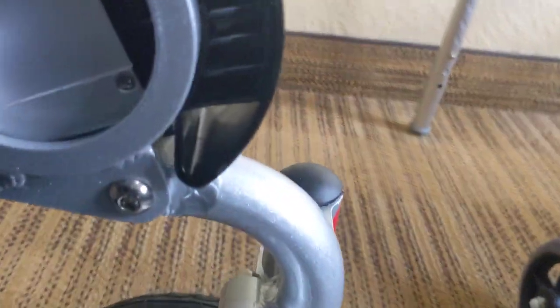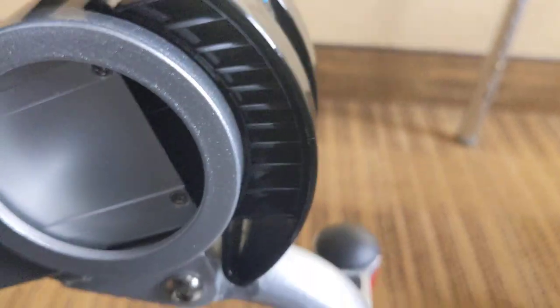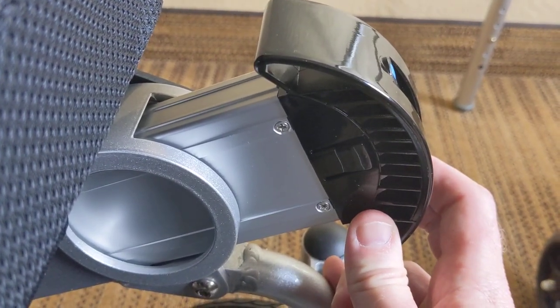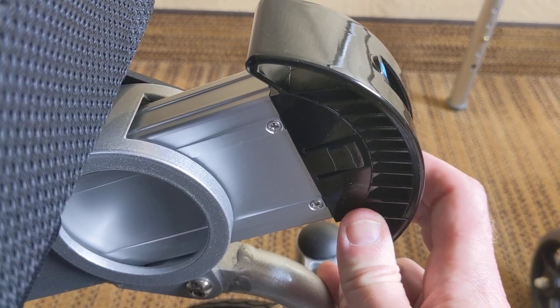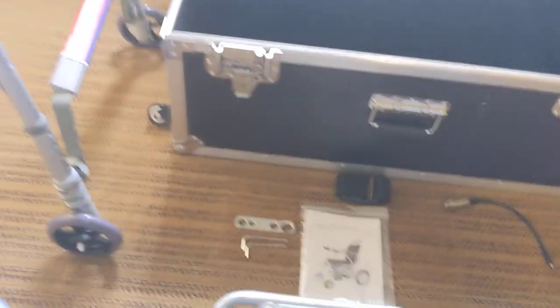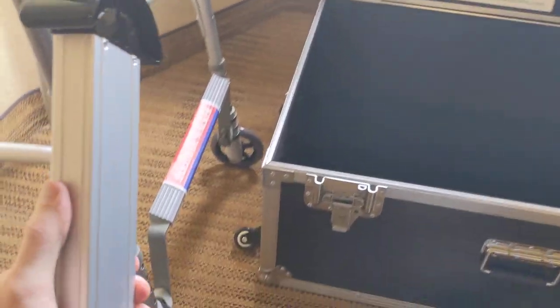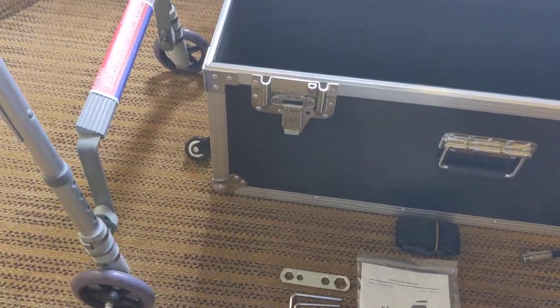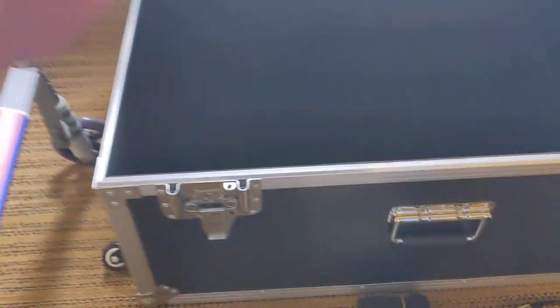There's a latch on the inside of the chair that will hold the batteries in place as well. Just because I only have utility of one hand right now, I decided to pre-loosen the battery. You have the batteries that are actually in the frame of the chair. That design really lets you get in the chair and, while seated, take the batteries out if you want to. It's a lot better than the backbreaker design of having a battery underneath the chair, and it's easy to deal with just one hand.